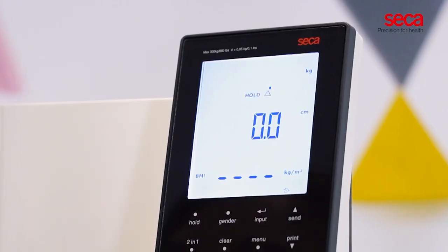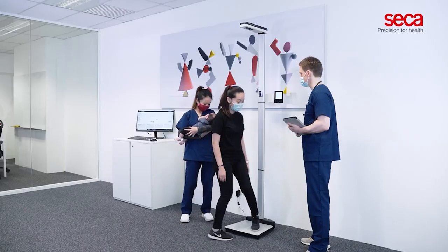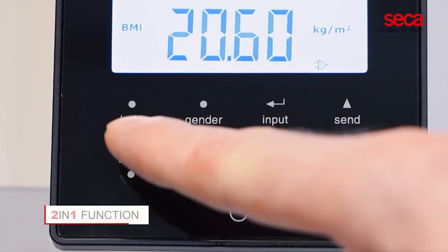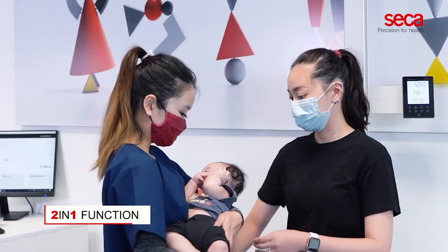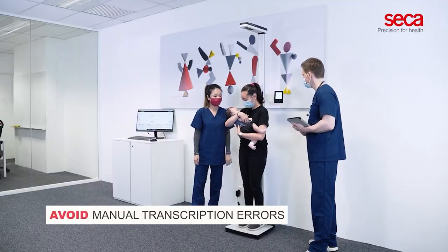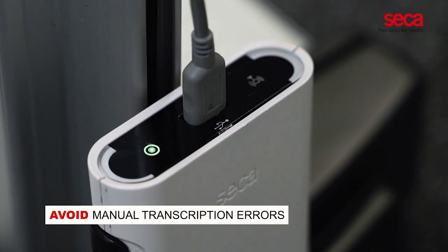Weight, height, and BMI are immediately displayed on the backlit 3-row display once the assessments are completed. The 2-in-1 function allows a restless baby to be weighed in the arms of an adult. To avoid manual transcription errors, the Sika 286 can be connected to any electronic medical record system.